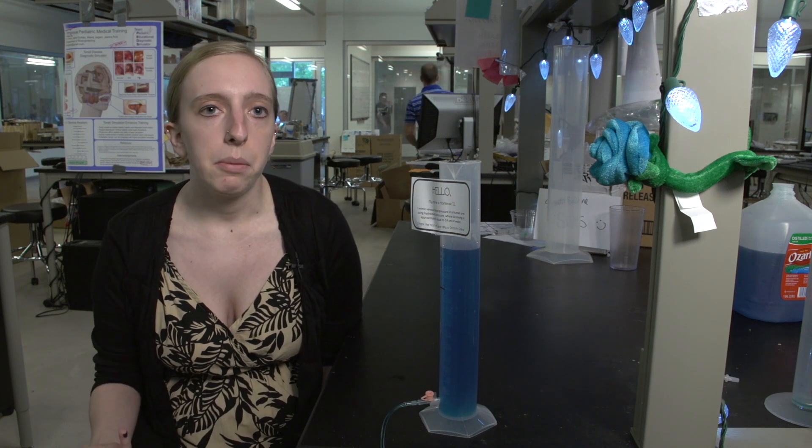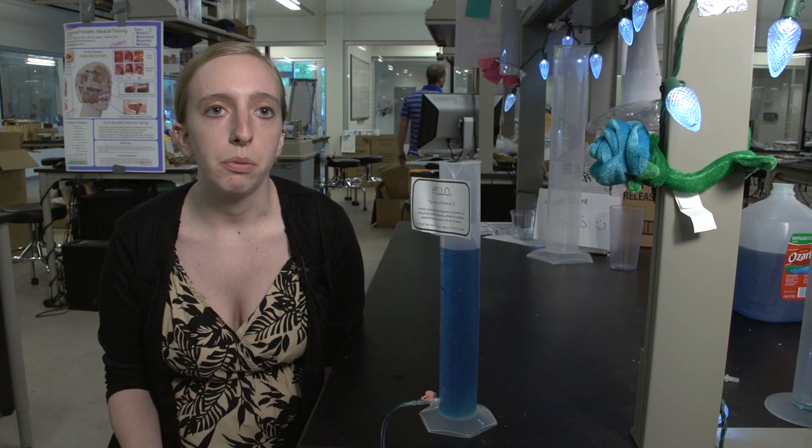The idea behind maintaining them properly is that they should be flushed routinely with sterile saline. So what we're trying to do is make catheter flushing accessible to these low-income environments in order to improve the health care of those patients and decrease the risk of infection.